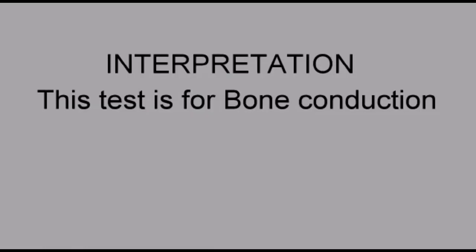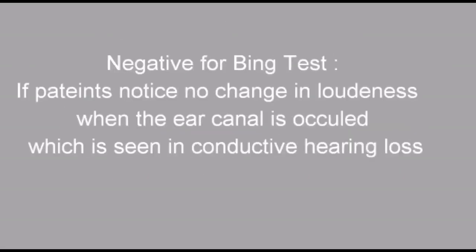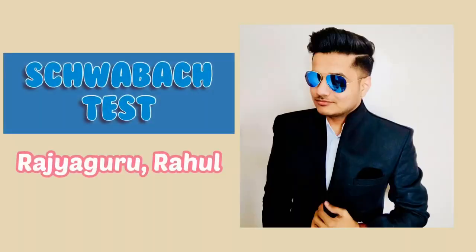This test is for bone conduction. If patient hears change in loudness when the ear canal is occluded, which is seen in normal ear or sensorineural hearing loss, indicates positive for Bing test. If patient notices no change in loudness when the ear canal is occluded, which is seen in conductive hearing loss, indicates negative for Bing test.